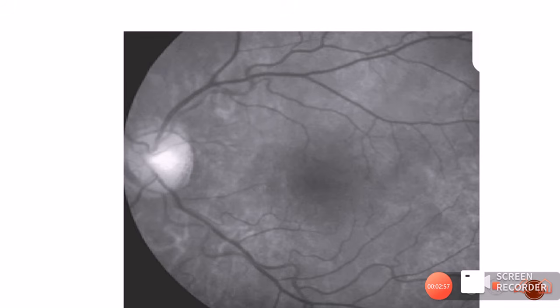Only the choriocapillaries are getting filled up, and as they are getting filled up, you can see a faint whitish fluorescence in the background, and on top of that you can see the black retinal vessel, and this indicates the choroidal phase of the FFA.